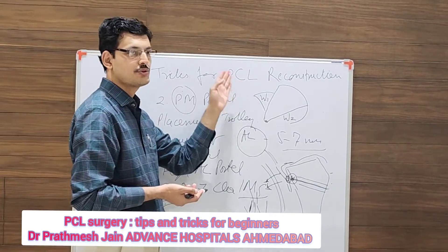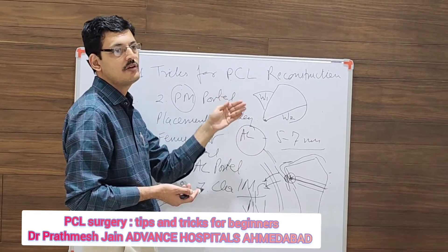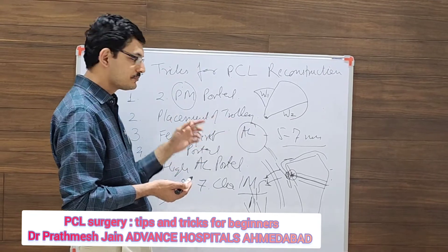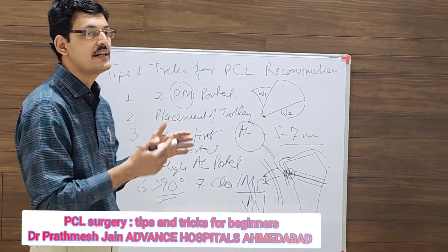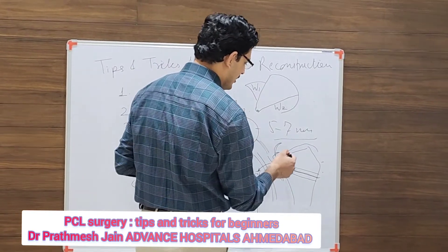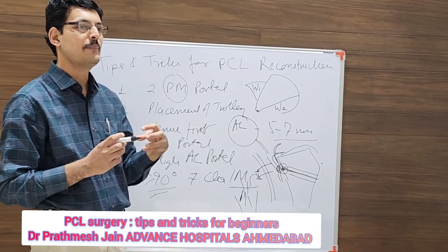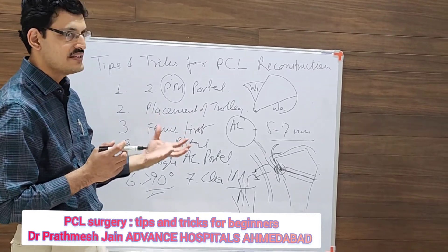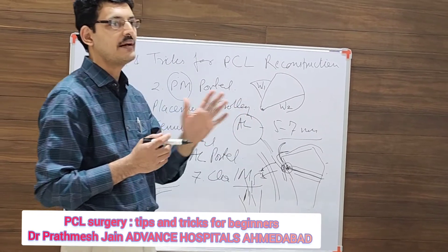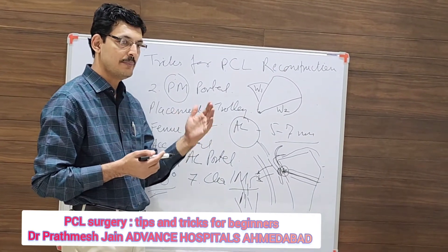Visualization will be done from the posterior middle superior portal, and the working portal will be the inferior posterior middle portal. Passing the graft can be difficult due to the killer turn. To negotiate this turn if the graft is tight, err on the side of a slightly wider tunnel — if your graft is 8mm, make an 8.5mm tunnel; if your graft is 8.5mm, make a 9mm tunnel. A 0.5mm over-reaming is better.